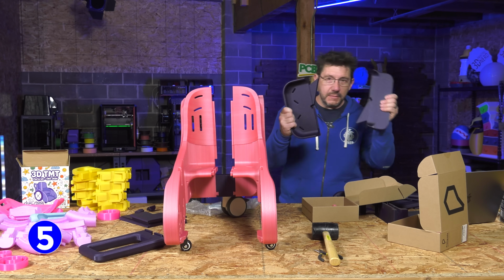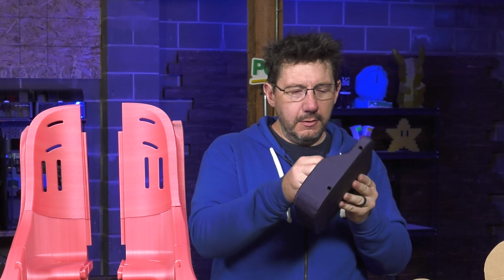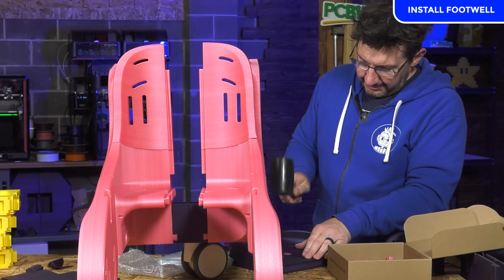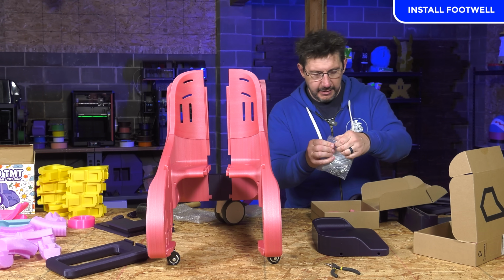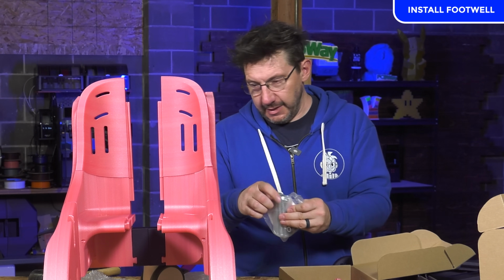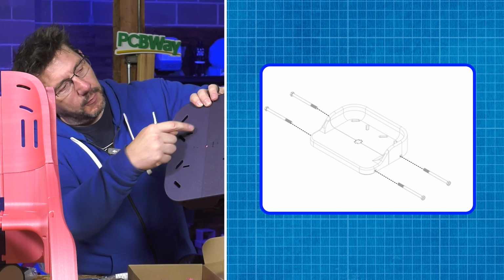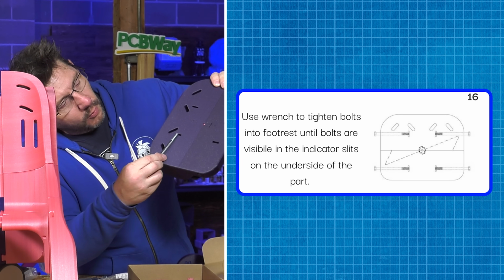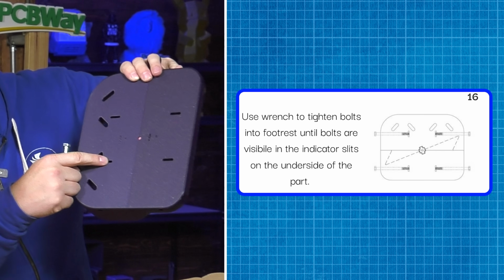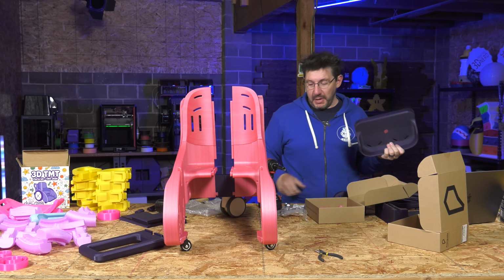Next step is this piece. Remember this piece, the footwell that I showed you? And you get one of these things to hold it in. It's such a good design. Oh, and now it wants me to put bolts in from either side. So that kit comes with the bolts that you need for this because it rests in there. It's got a little guide here. So on the bottom of the footrest, you can see there are 4 slits, and each of those are so that as this goes in and gets tightened, once you see the bolt in the slit, you know it's been tightened enough. I know this is okay because I saw Gnome do it with Coach P on their video.